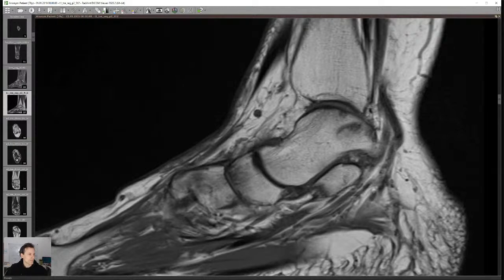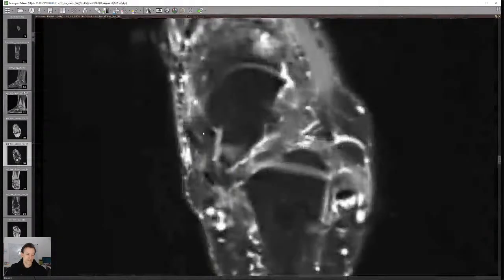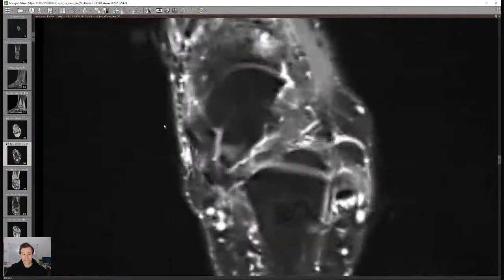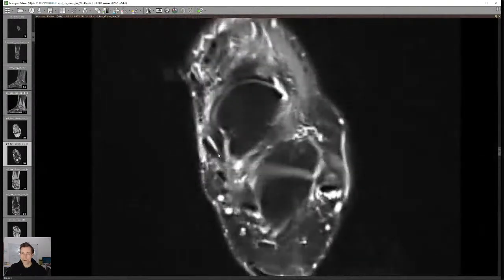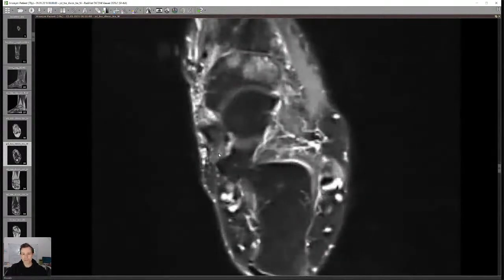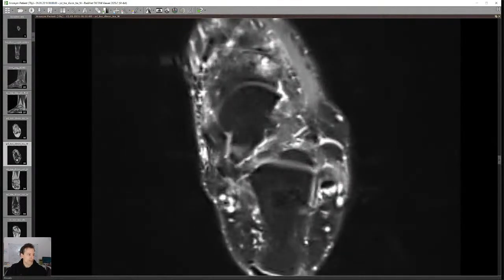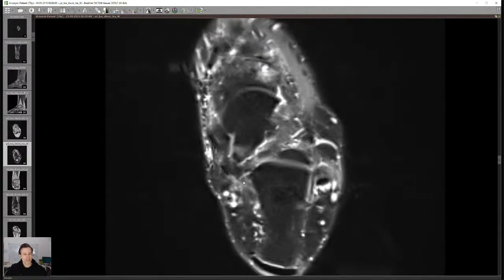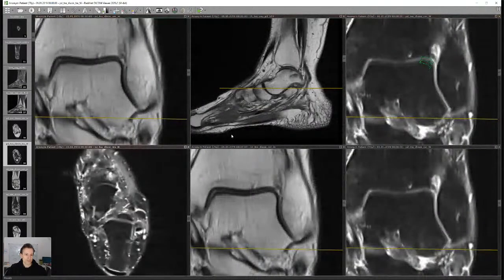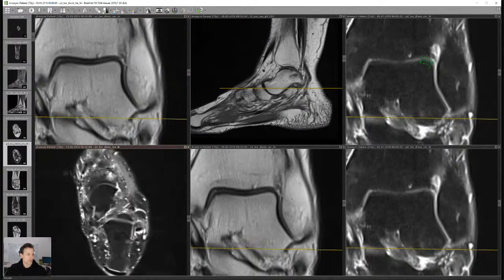Tibialis posterior and spring ligament tendinopathy are very vague terms. Signal changes are not always obvious — sometimes the tendon is thick, sometimes not. You can always say tendinopathy and nobody can prove you wrong, but it's not always clinically relevant. The whole impingement topic is difficult — it's really more about looking for anatomic abnormalities and ruling out other pathology. Check the ankle impingement videos on YouTube for more detail.